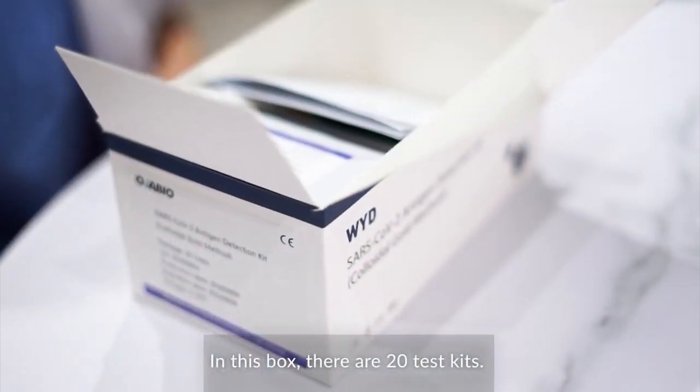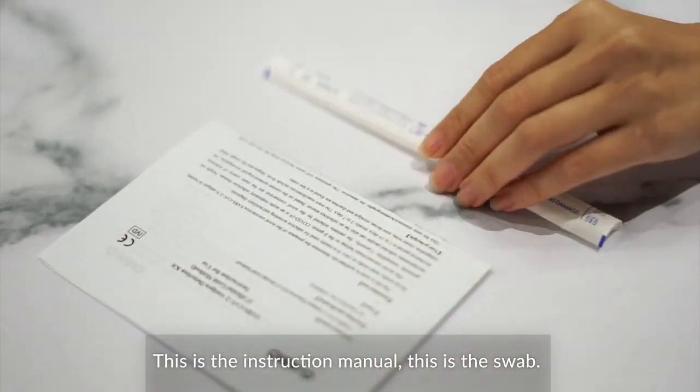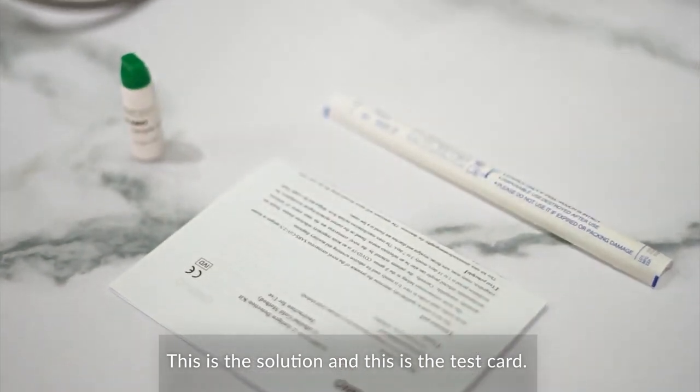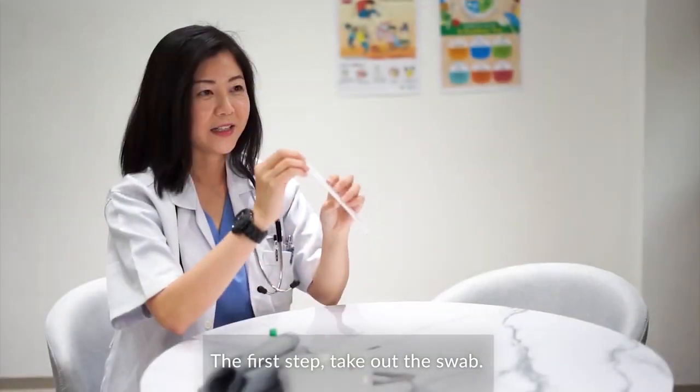In this box there are 20 test kits. This is the instruction manual, this is a swab, this is the solution, and this is the test card. The first step: take out the swab.